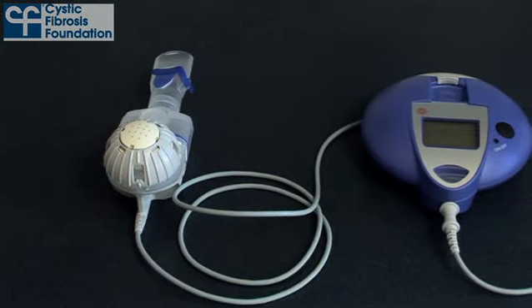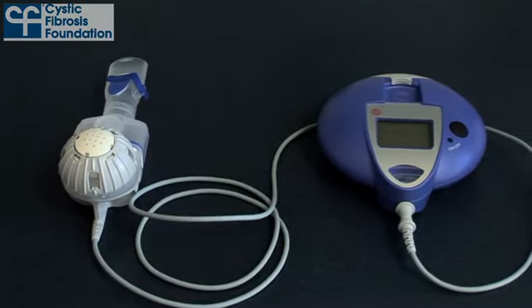Hi, I'm Angela Sisi with the Cystic Fibrosis Foundation. Today I'd like to show you how to clean and disinfect your Altera or eFlow nebulizer system based on the Cystic Fibrosis Foundation consensus.